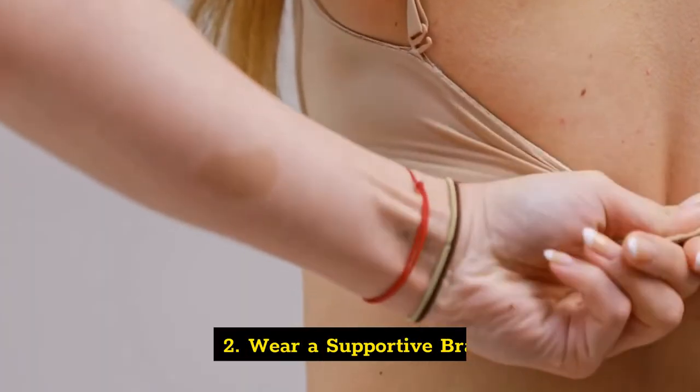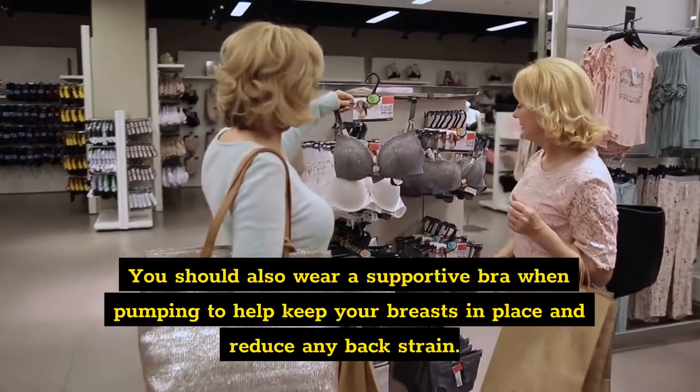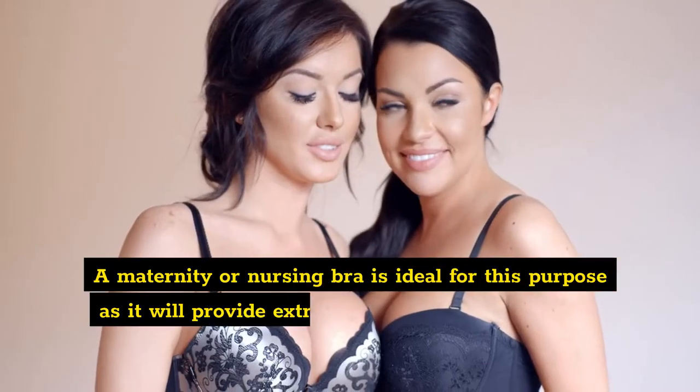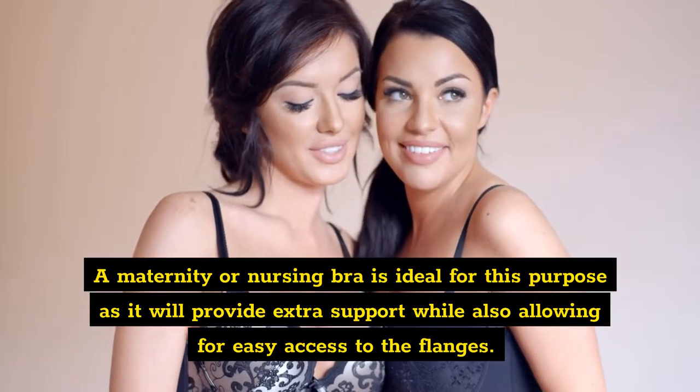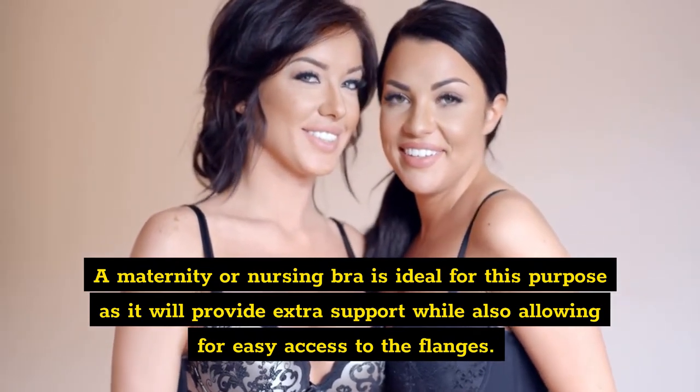Two: wear a supportive bra. You should also wear a supportive bra when pumping to help keep your breasts in place and reduce any back strain. A maternity or nursing bra is ideal for this purpose, as it will provide extra support while also allowing for easy access to the flanges.